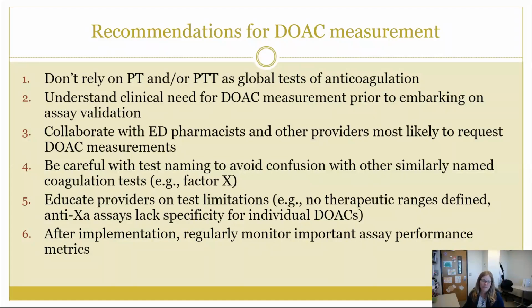And then finally, it's always important to monitor assay performance metrics after implementing your assay. So for us, for example, we were live for a few months before realizing that our turnaround time was actually not good enough, and we needed to make some changes as to how we had the assays available on our instruments in order for the assay to be useful.